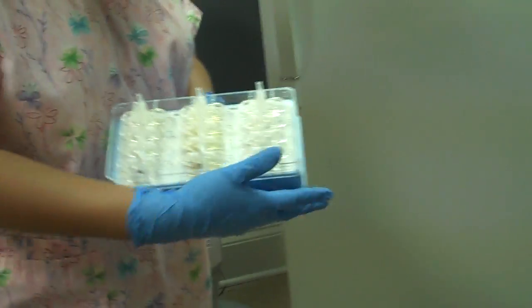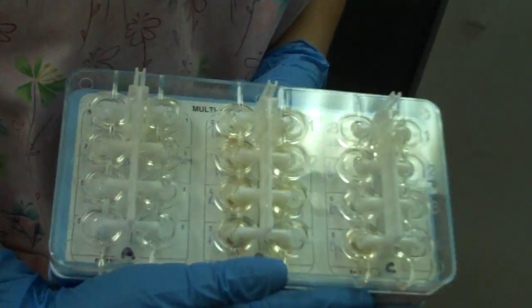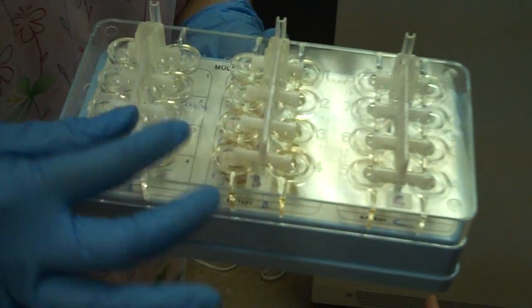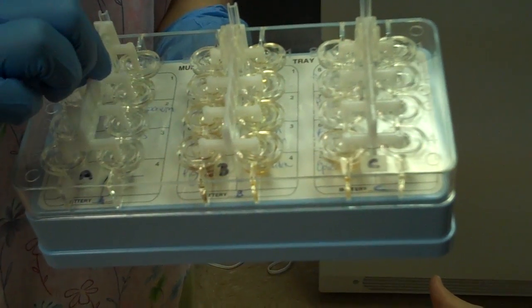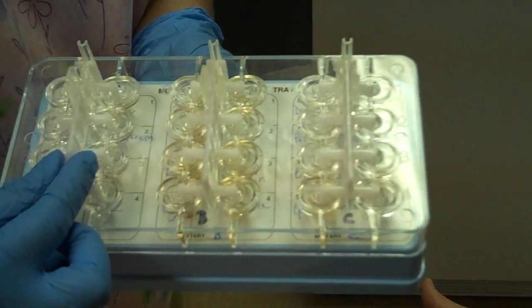The skin test device is what the actual device looks like. It is comprised of eight different small prongs. It's called a multi-test device.